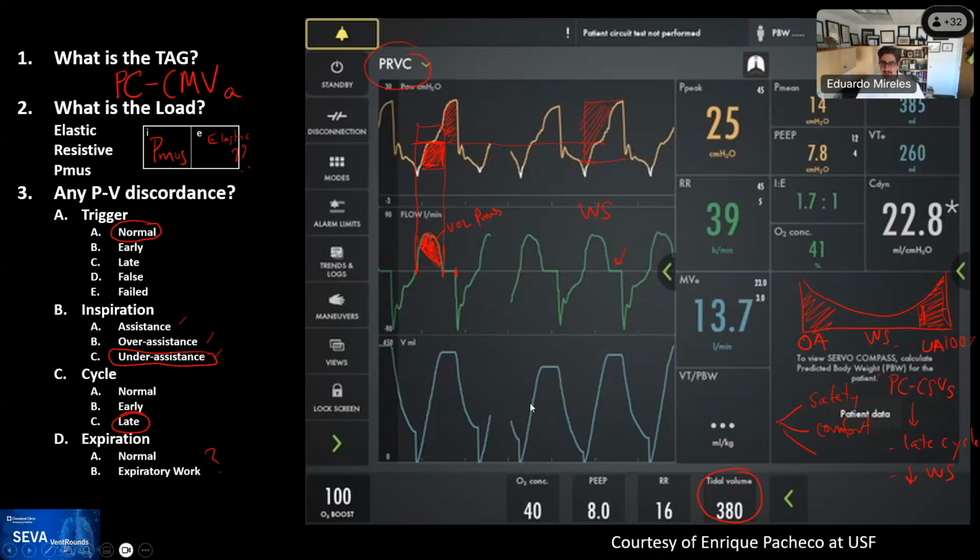No, I would just summarize that by saying if the primary goal is comfort, and we're talking about synchrony here, then the fundamental problem is that the set inspiratory time doesn't match the neural inspiratory time. So simply get rid of the set inspiratory time. Yeah. And actually, that's another important thing. That's why I think sometimes choosing wisely matters here.